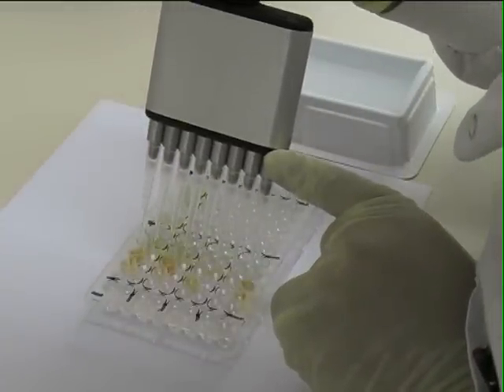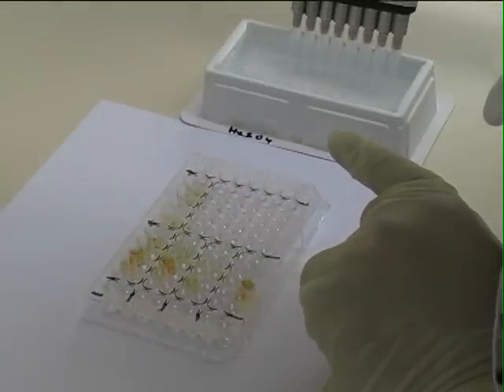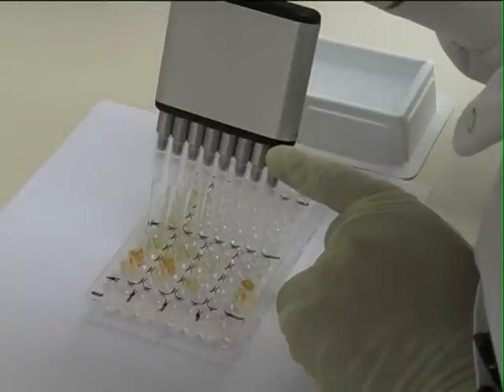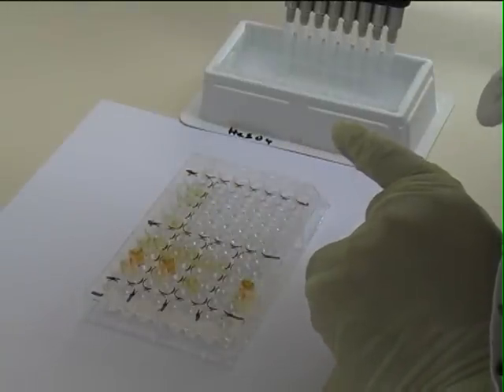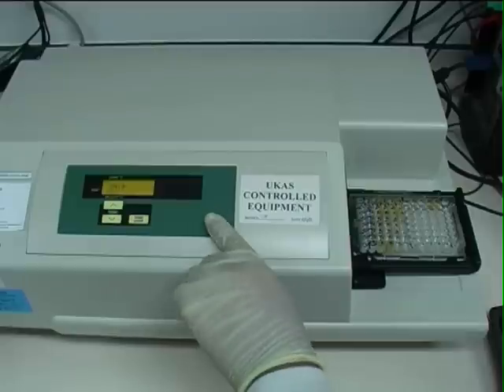After the colour has developed sufficiently, dilute sulphuric acid is added to all the wells to stop the reaction and the optical density of each well is read in a plate reader.